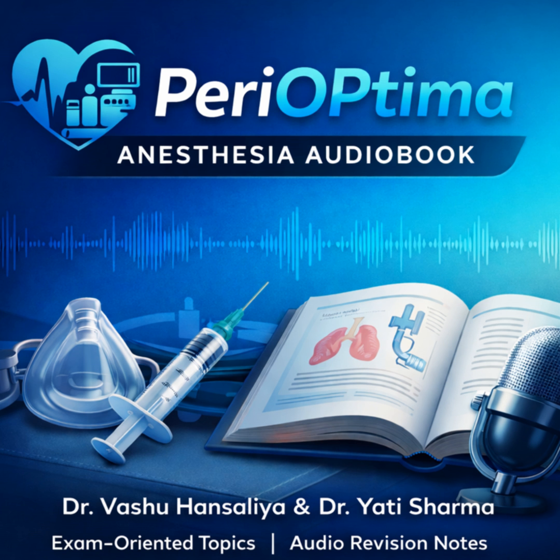Okay, let's talk about another workhorse mode, assist control, or AC. The name itself can be a bit confusing for students. It can be, but let's break it down. AC means 2 things are happening. The control part means that if the patient does absolutely nothing, if they're deeply sedated, the machine will deliver a controlled set rate of breaths, say 12 per minute. That's the backup.